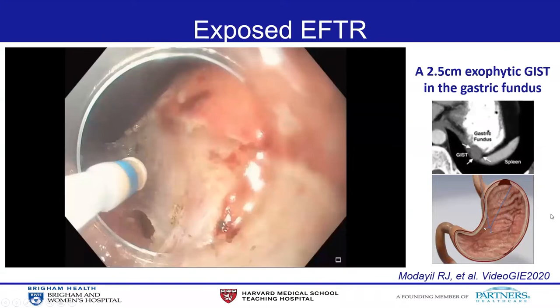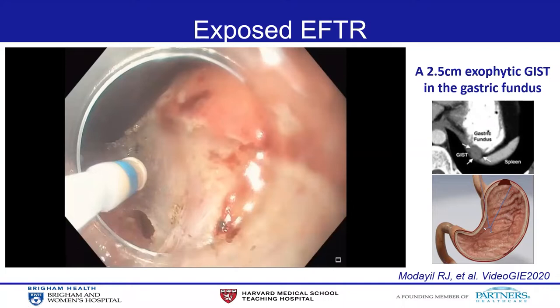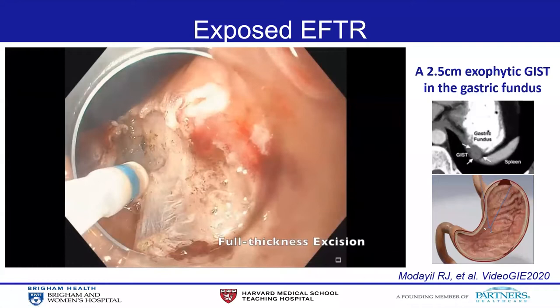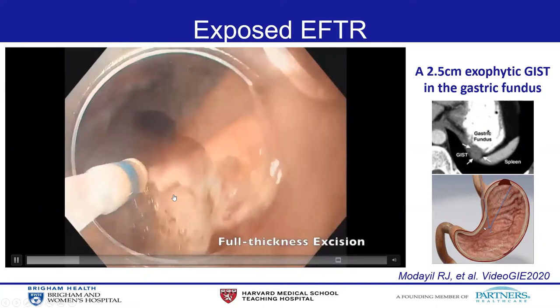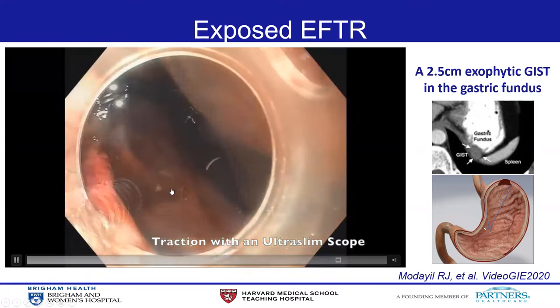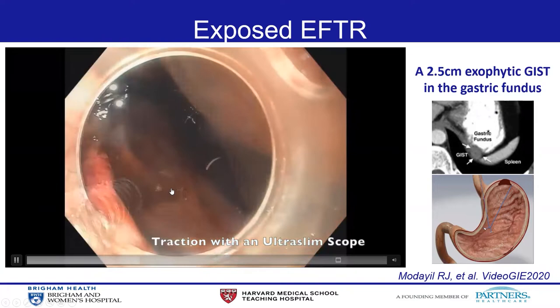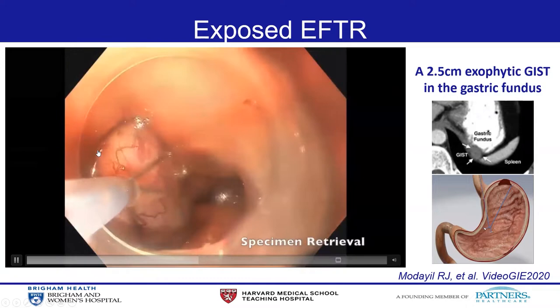I'm going to show a case video of a 2.5 centimeter GIST in the gastric fundus with exophytic growth. This case is not a good candidate for non-exposed EFTR because of the size — larger than 2 centimeters — and because of the exophytic growth pattern. First, the periphery of this lesion was incised in a full-thickness fashion. Then, using a grasper, the target lesion was pulled back into the stomach and passed to the other grasper with an ultra-slim scope. Using a hook knife, the lesion was completely removed en bloc.